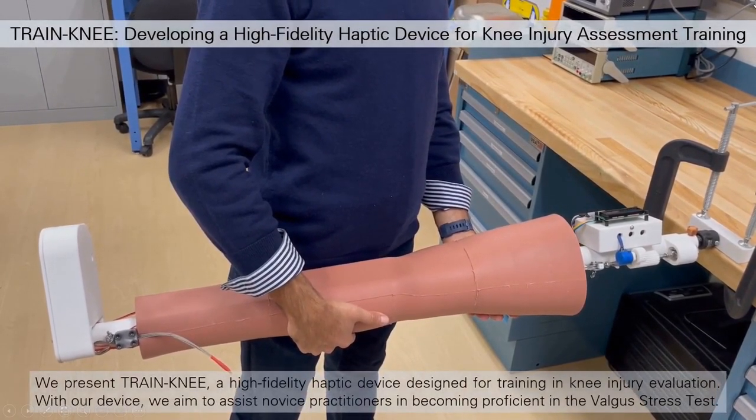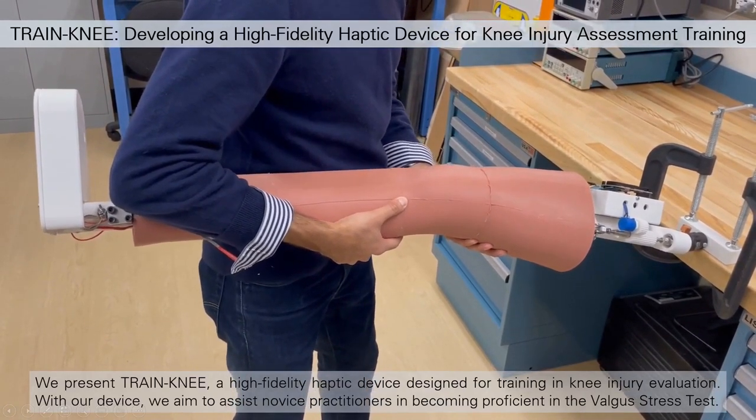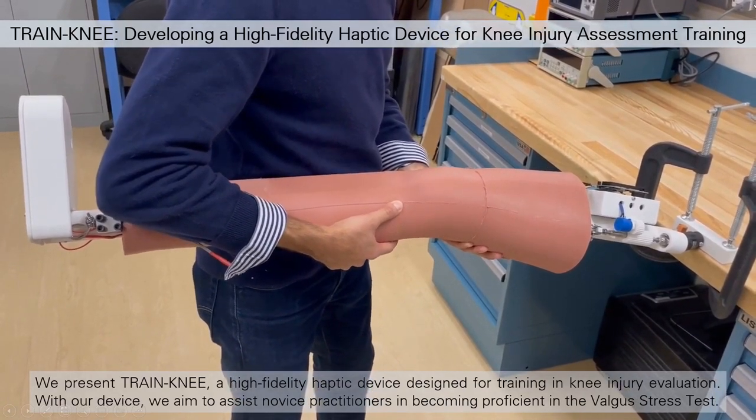We present TRAIN-KNEE, a high-fidelity haptic device designed for training in knee injury evaluation. With our device, we aim to assist novice practitioners in becoming proficient in the Valgus stress test.